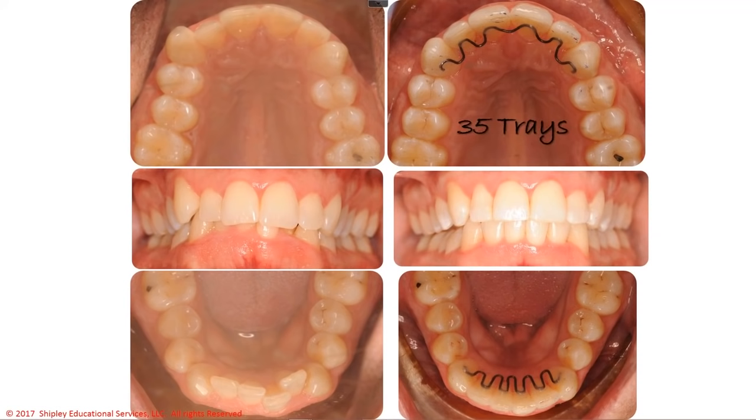I thought we could maybe get this dialed in a little bit better, like with that lower left cuspid. He said, no, thank you, I'm done. He came in asking for Propel. He was a referral from another Propel patient, so he came in asking for it. So we did it on the first treatment visit, and with 35 aligners, we were able to finish this case in 4 months from beginning to end and get the fixed retainer in.